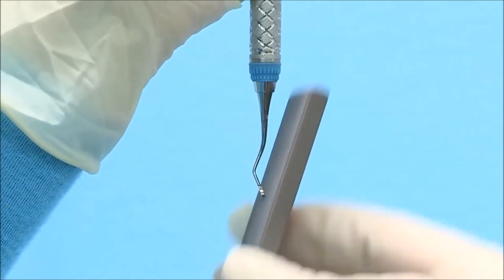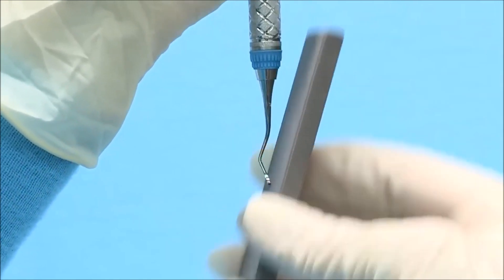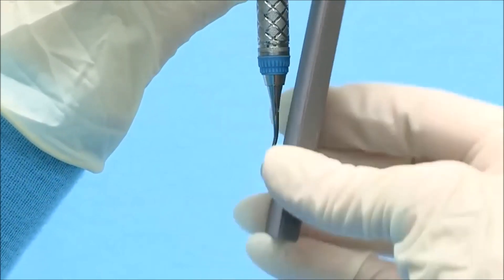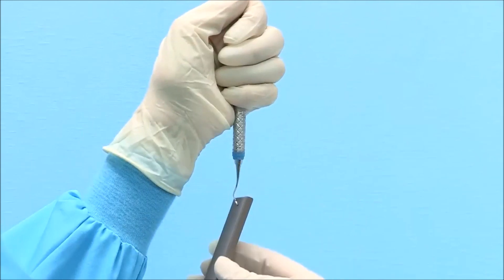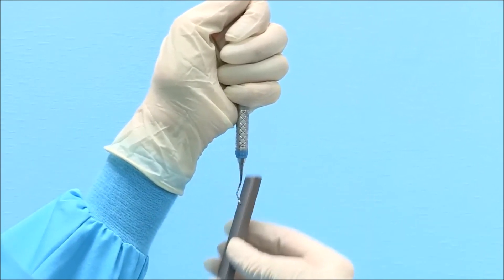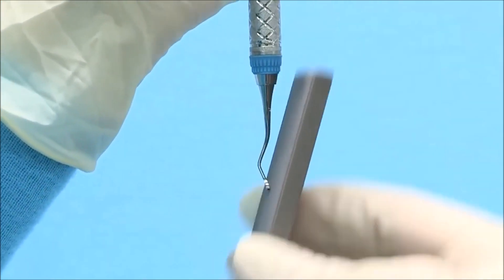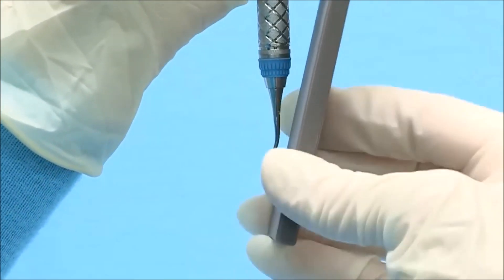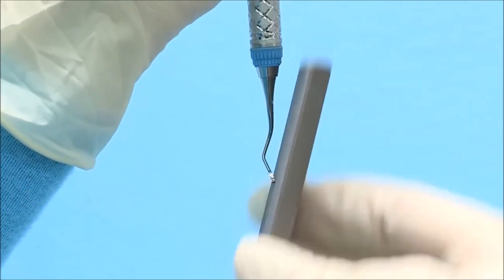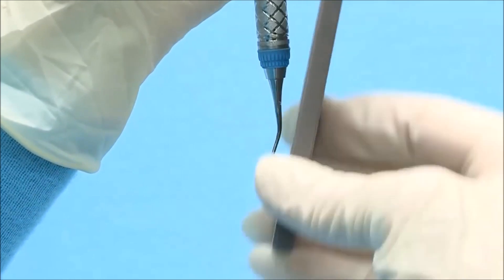Initiate sharpening in a consistent up and down motion starting at the heel third and continuing to the middle third and finally the toe third. It is important to remember that the blade of a Gracey curette is straight and not curved. When sharpening, do not rotate the stone as you move from the heel to the toe of the blade. Instead, proceed with sharpening in a straight line from heel to toe, as this will preserve the original blade design.